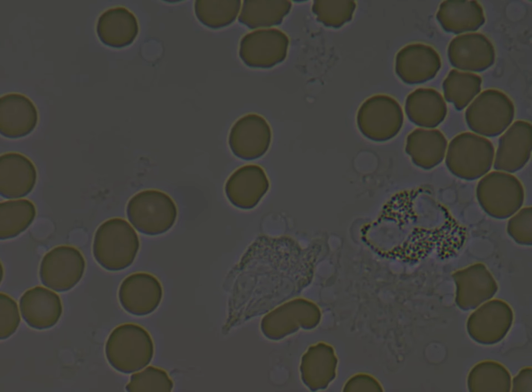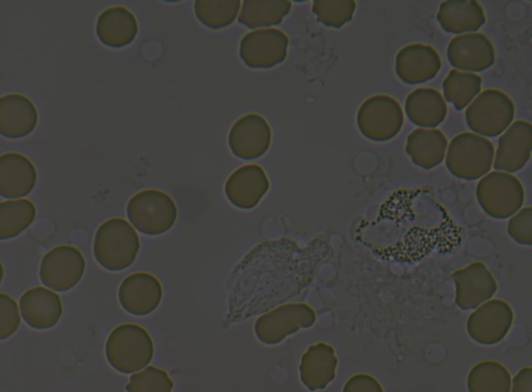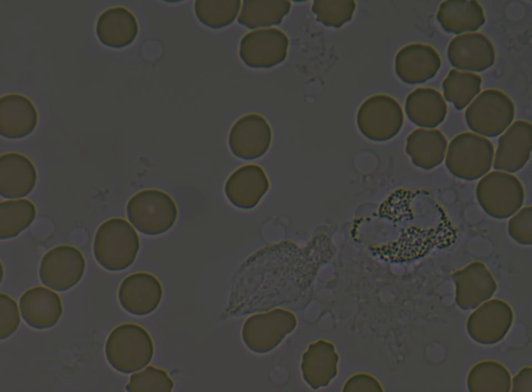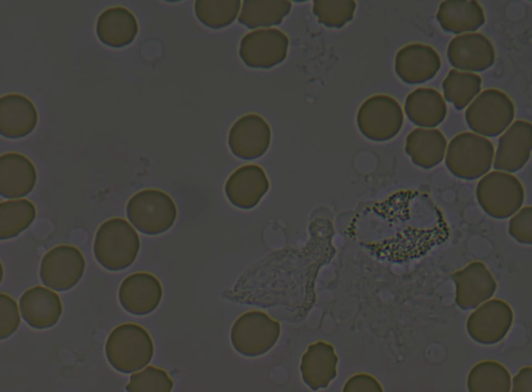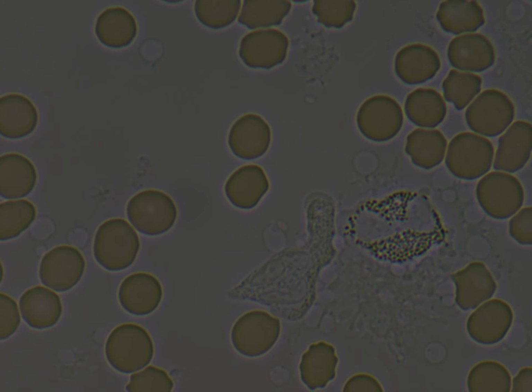So, in summary, it is very seldom that you can meet an eosinophil, if you compare with the neutrophil we see on the left side. And of course, to see one eosinophil in a small smear is a big luck.